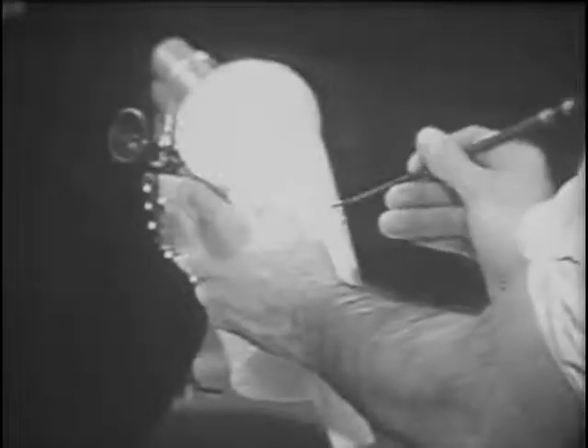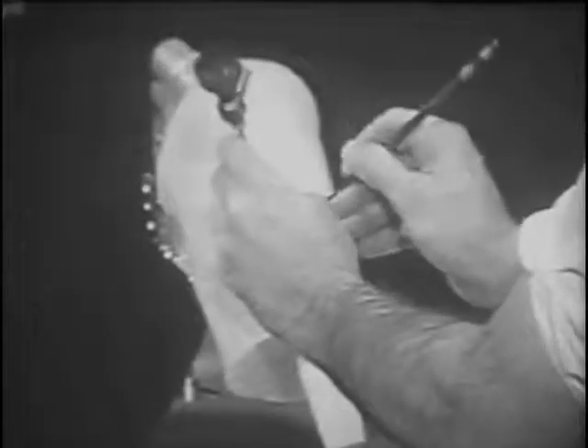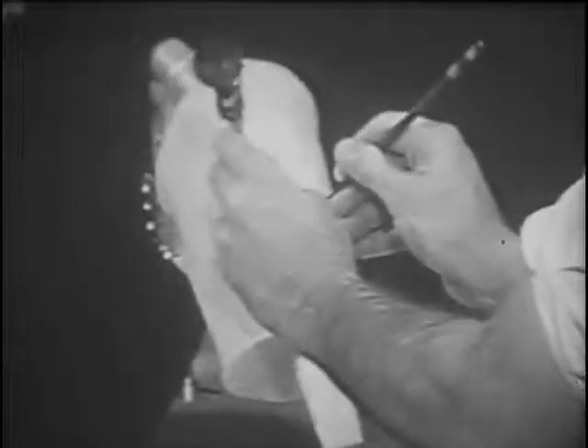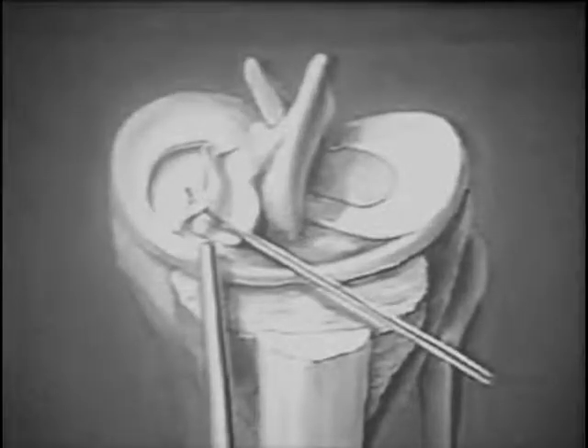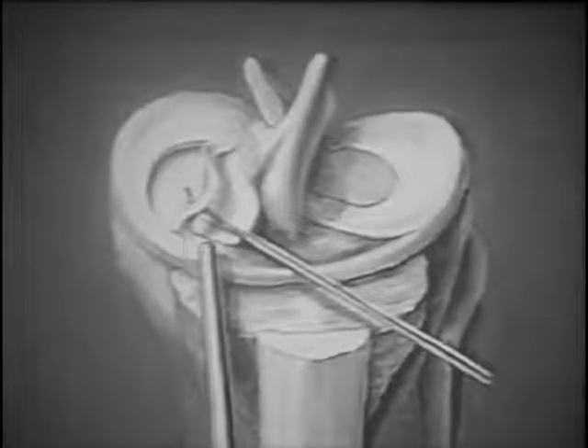Using a simulated knee with a medial bucket handle tear of the meniscus, a diagnostic scope is inserted in the medial side and a nerve hook is inserted through a lateral puncture. Diagrammatically, we see the bucket handle tear with the nerve hook around it. The nerve hook probes the tear and defines its limits.